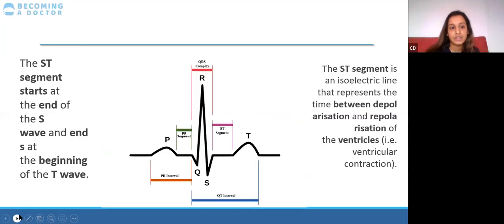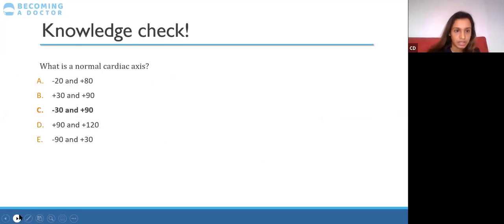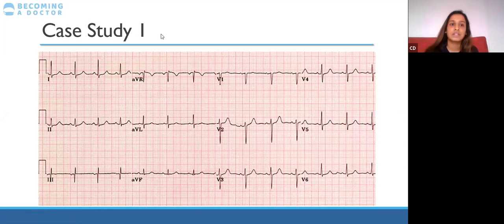Every ECG that you see that is supposedly a normal ECG should look somewhat like this one in terms of everything being in the normal place. And the way that you tell that, like I said, is to use the 6-question strategy and look through those different things. Sometimes things might look different, but if you calculate the PR intervals and they're all normal, you can still say it's a normal ECG.